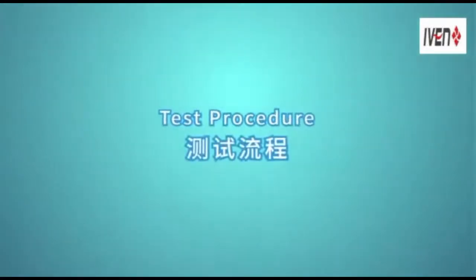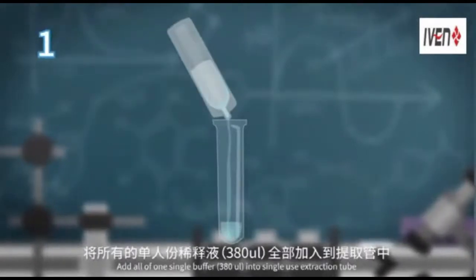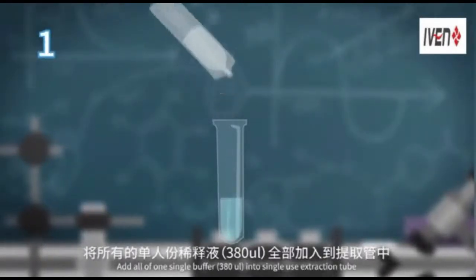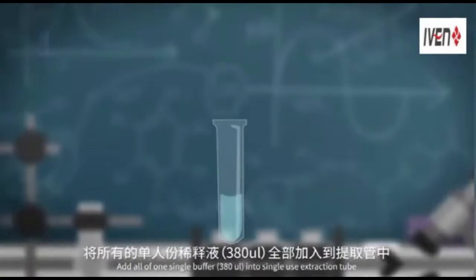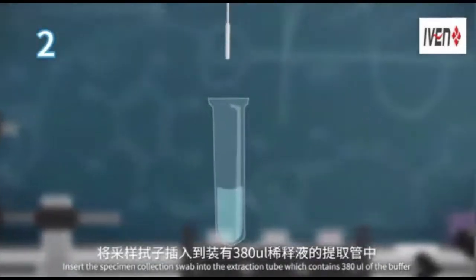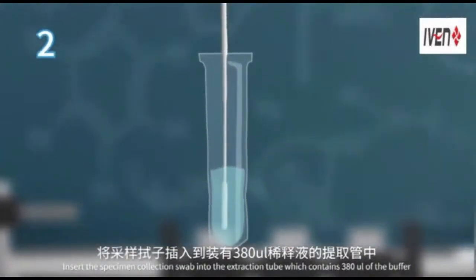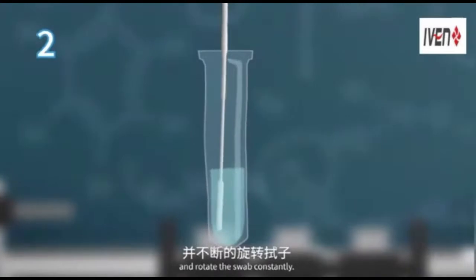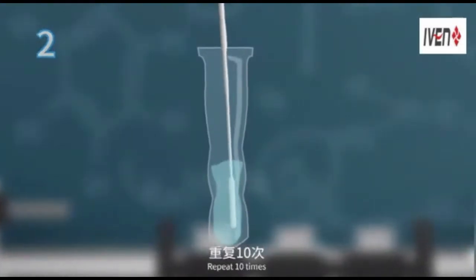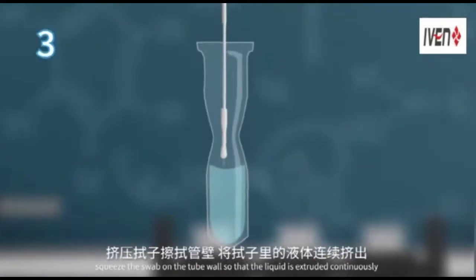Test procedure. Step 1. Add all of one single buffer, 380 microliters, into a single-use extraction tube. Step 2. Insert the specimen collection swab into the extraction tube, which contains 380 microliters of the buffer, and rotate the swab constantly. Repeat 10 times. Step 3. Squeeze the swab on the tube wall so that the liquid is extruded continuously.